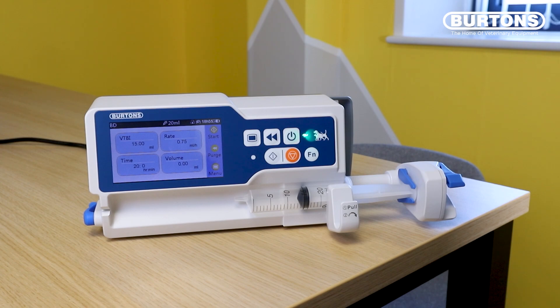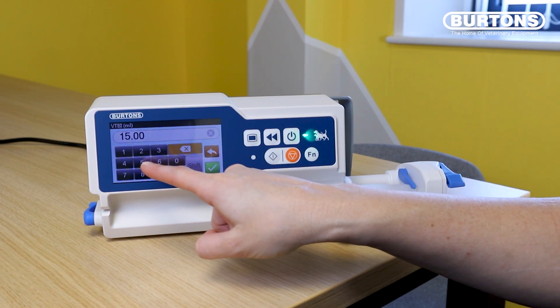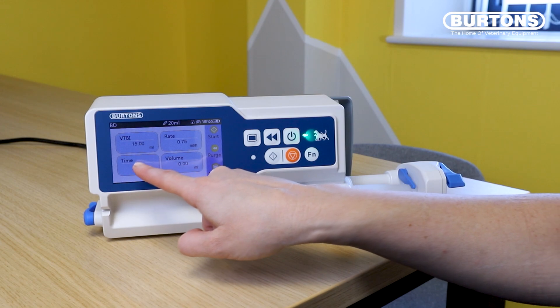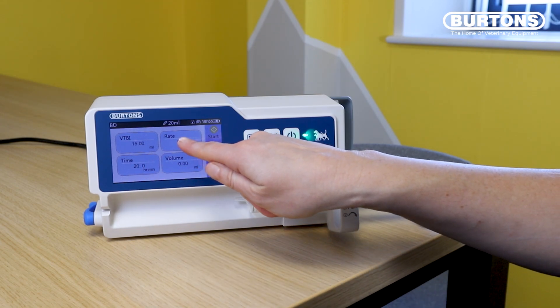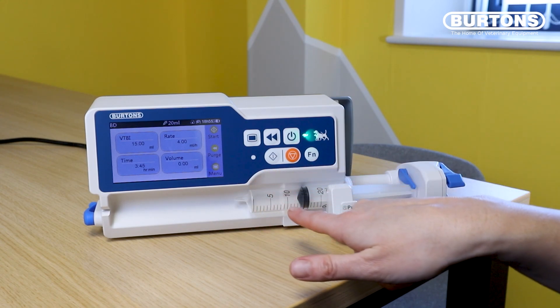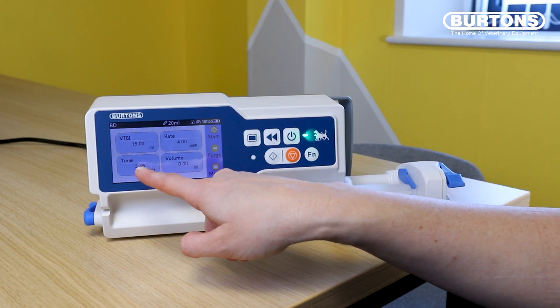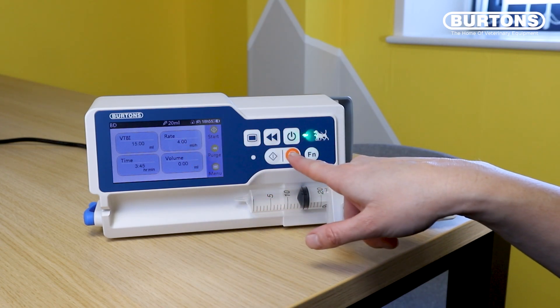If you would like to instead set an hourly rate to run for our patient, all you need to do is still fill in the VTBI — the volume to be infused — at 15 mils as we had before, but instead of saying we'd like this to go in over 20 minutes, we can actually say I would prefer to put this patient on a rate of maybe 4 mil an hour. That means this syringe in particular with 15 mil of our drug in it is going to be infused over 3 hours and 45 minutes, and then we can just hit start here or here.